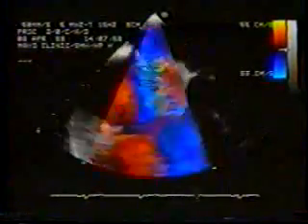In color flow mode, you can clearly visualize this large bolus of flow going across the atrial septal defect. You can see this vividly also in real time, and the shunt is represented in shades of blue.